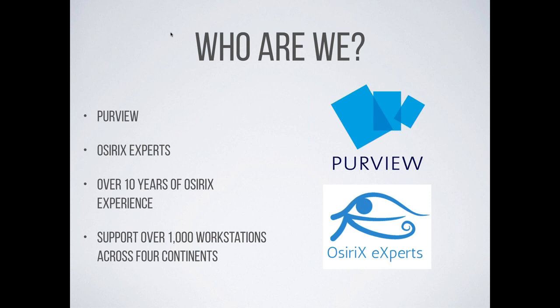It is critically important to us that Osirix lives on in a way that's meaningful to its end users, in a way that's not restrictive, in a way that empowers physicians, educators, researchers, at their desktop, at their computer with medical imaging.